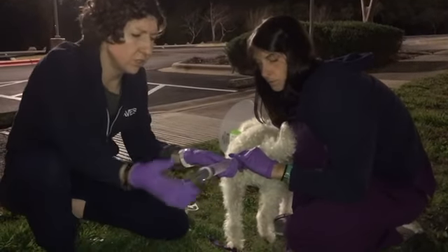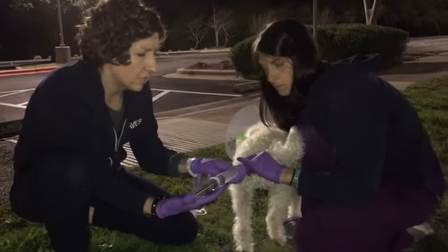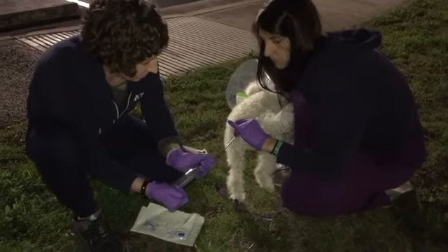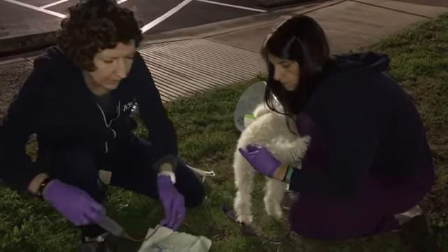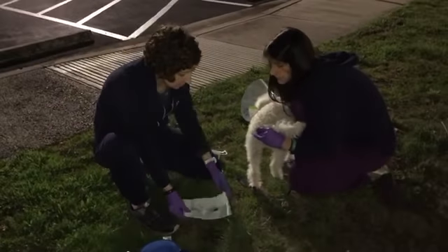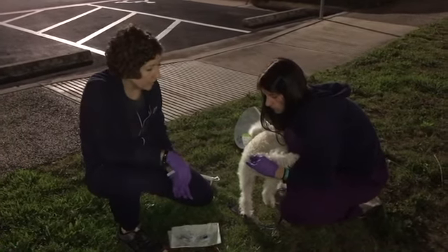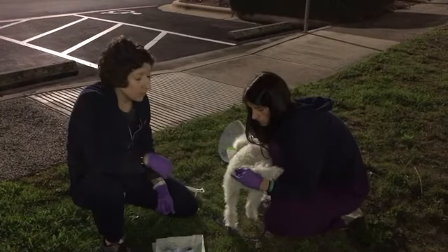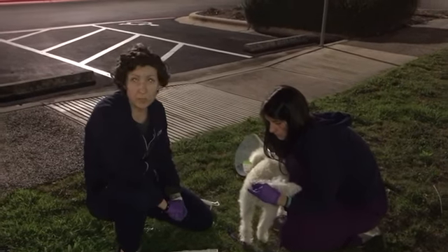All right, and I'm just going to insert this just nice and steady, not too fast. Good boy, buddy. All right. Okay, and so we did this outside, so it's a little bit less mess to clean up inside. So what we're going to do is hold the rectum shut for a couple more minutes, and then we're going to walk around outside with him to see if he can eliminate some of that enema. And that is how you perform an enema on a dog.